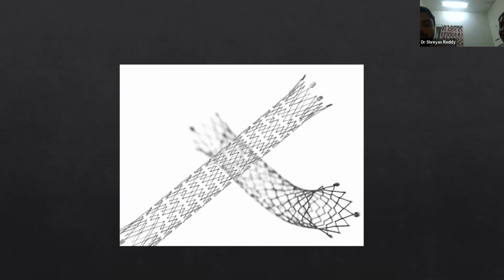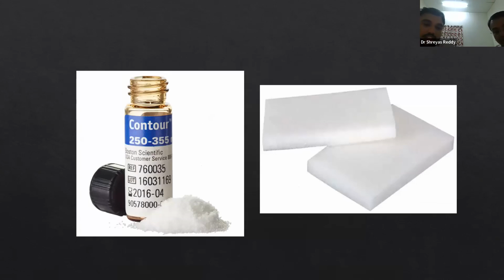You measure the size of the vessel on CT or the fluoroscopic image. Okay, then you decide on the stent. Okay, fine. So what are these two agents? The first image is that of the PVA particles, and the second is of the gel foam.